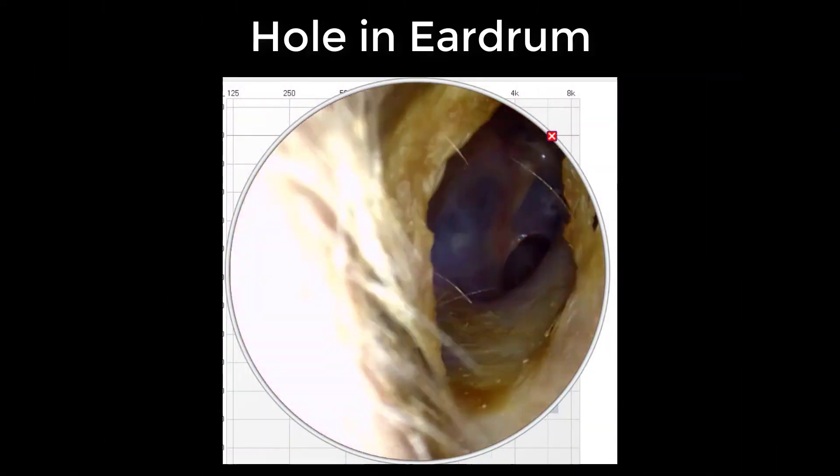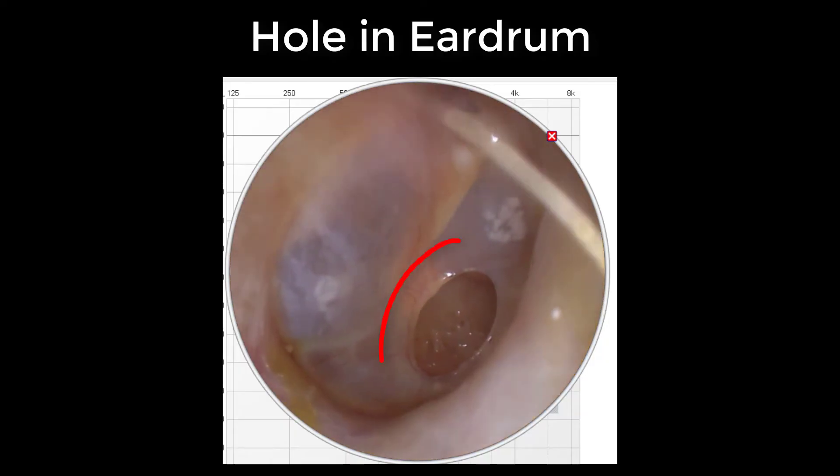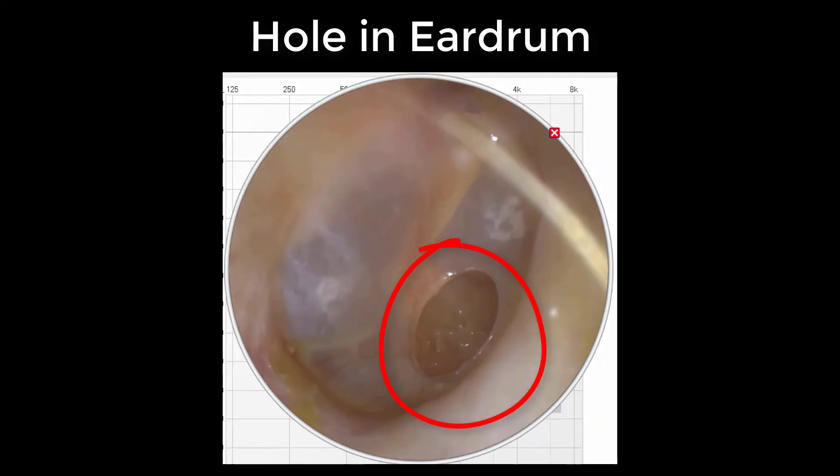Next, we have another cotton swab attack, and this individual wasn't quite as lucky. You can clearly see that there is a hole inside of this individual's eardrum. Ear canals are not very deep, and the eardrum is only made up of three layers of skin, which means it doesn't take a whole lot to cause a lot of damage.